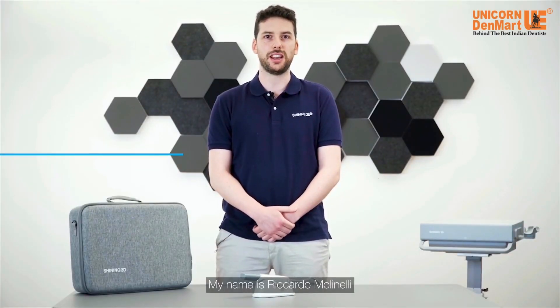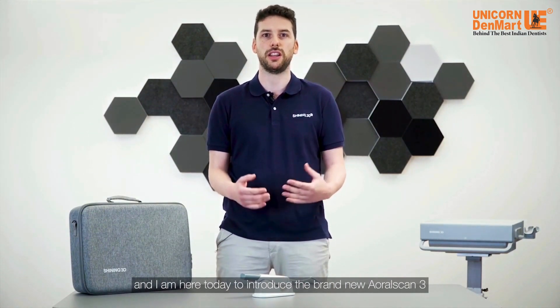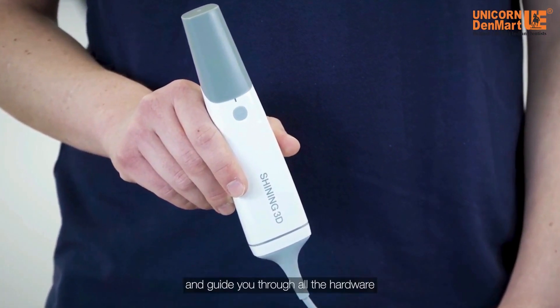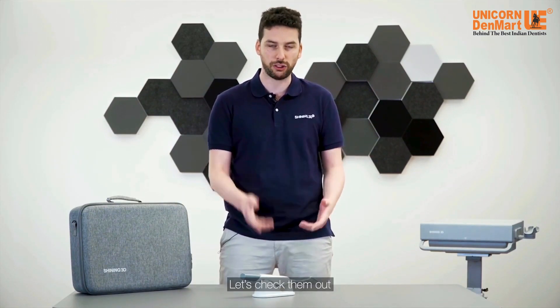Hi everybody, my name is Riccardo Molinelli and I am here today to introduce the brand new Aoralscan 3 and guide you through all the hardware and software news available with that. Let's check them out.